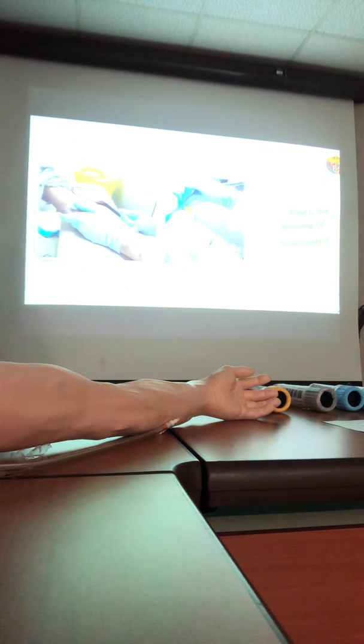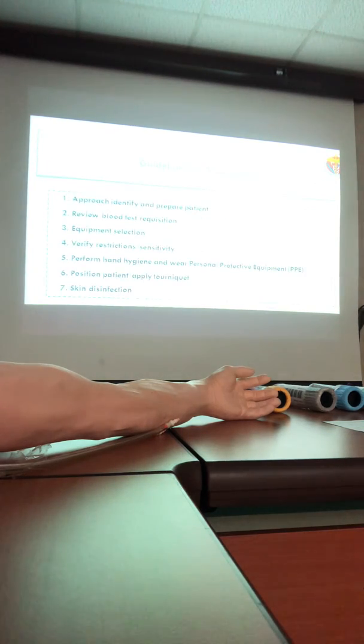So what's the meaning of phlebotomy? As I mentioned before, it is cutting of the vein. In the past it was cutting, but now it's venipuncture.